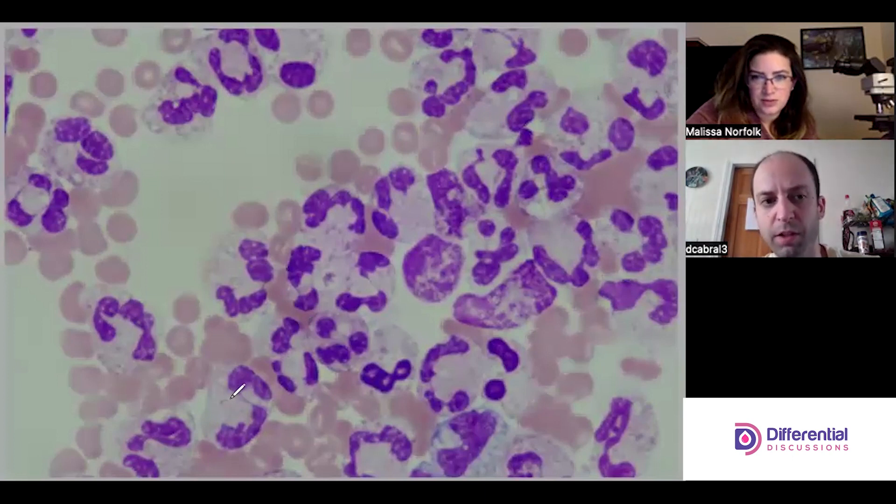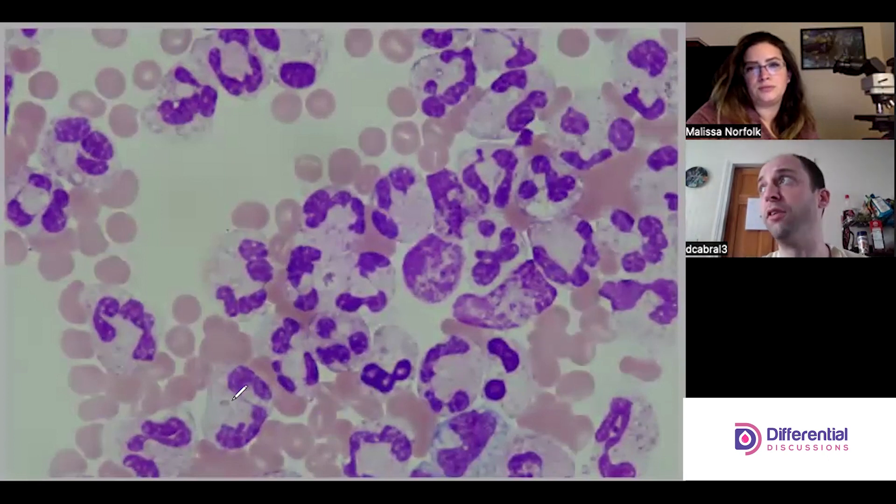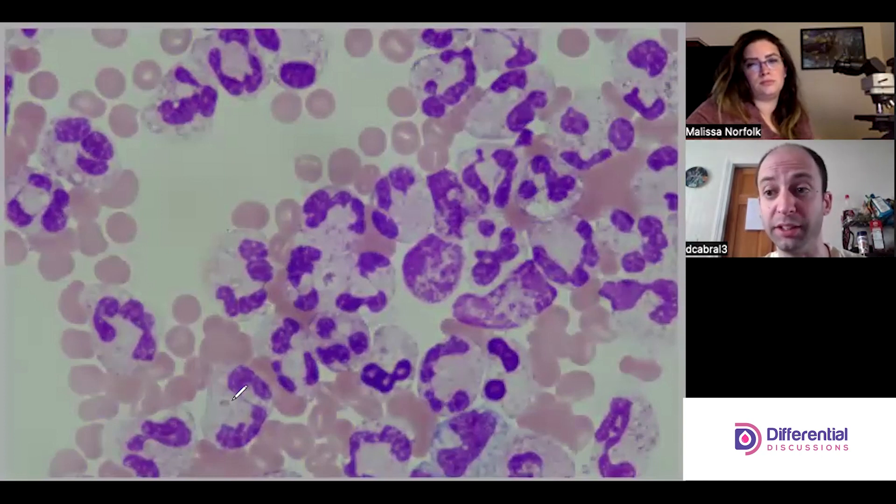There are other methods for testing, looking for, and identifying crystals that we're not going to cover here, but it's still prudent to qualitatively note that they're present — that assists the clinician a lot. Think about what the clinician is going to get pretty much right away from the laboratory: the cell count.